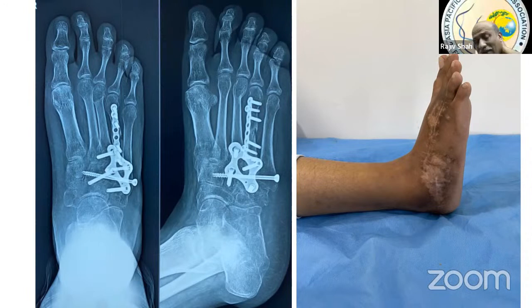So similarly, before you go into the surgery, you manipulate and look for this instability. And when you open it, you see that the capsule ligament structures are already lost, and you will be able to see that this has gone highly unstable. So this is how the first screw went in, and then to make this whole unstable thing stable, I had to put in a plate bridging the third and fourth ray. And obviously this has to be removed as soon as possible. And a plate for the metatarsal fracture.